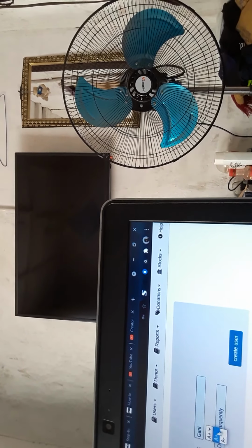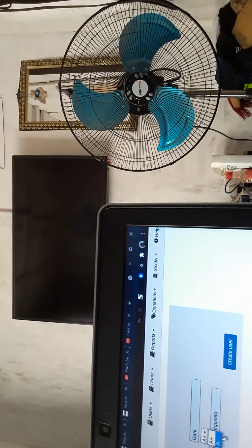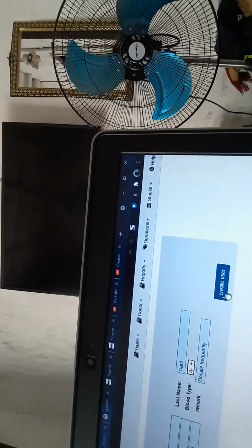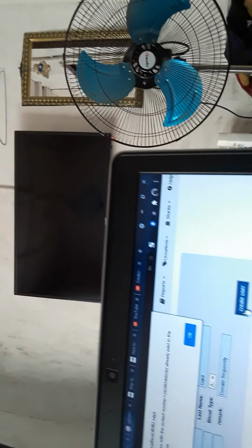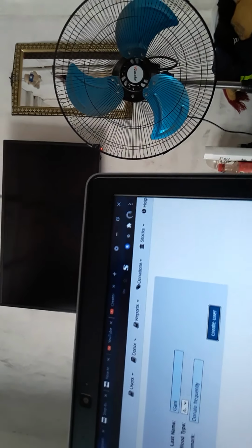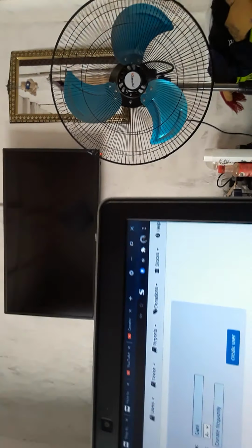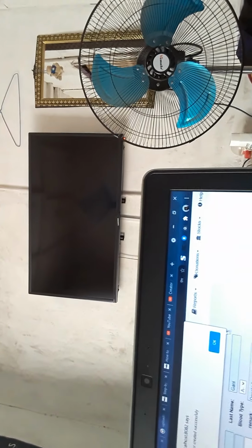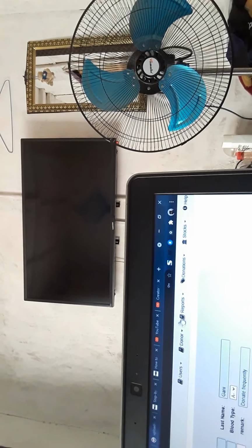These are the groups according to what the system has at the moment. It may reject if the contact number has already been inputted into the system. For instance, this number is already in the system; I was the one using it. Let me try changing at least one figure, then create again. The donor has been created successfully.